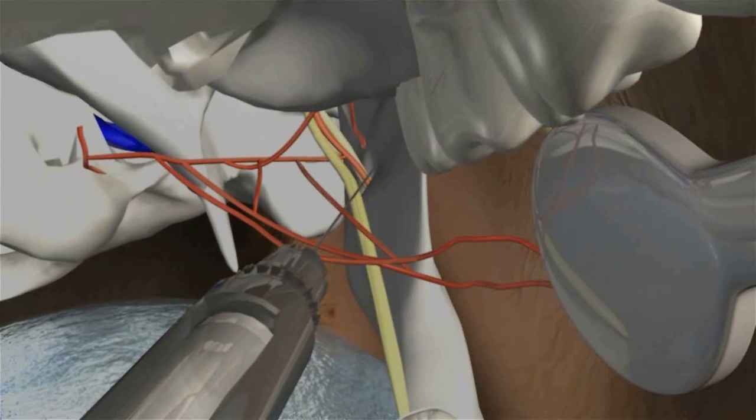Let's take a closer look at the anatomy with the needle in correct position. You can appreciate where the tip should be, and its proximity to the lingula, medial ramus, and the neurovascular bundle. You can see why there is the possibility of a positive aspiration with the nearby vessels.